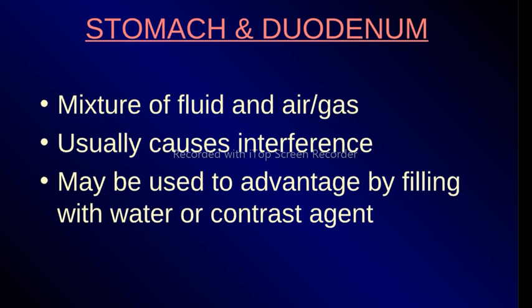So we'd rather use water, even if they just took it from the dispenser, those hospital dispensers, it's okay. It's enough to displace small pockets of air so that we can see what lies behind the stomach. But using ultrasound to assess the stomach itself is problematic because of that reason. And that is why we end up doing other studies like barium meals, endoscopy, CT, etc.